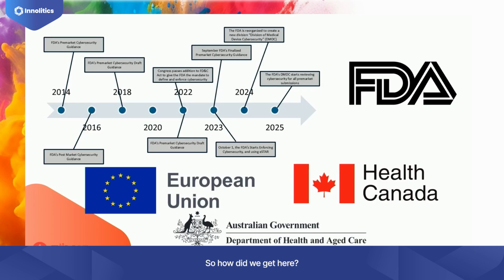So how did we get here? Well, over the last 10 years or so, starting in about 2013, the draft pre-market cybersecurity guidance came out from the FDA. It was 7 pages in length and basically said you need to make your medical devices secure, and we like puppies and unicorns are cute, with no concrete examples of what that actually meant or how to prove it to the FDA. Huge disservice to our industry as developers because nobody knew what to do. So when you're confused and don't know what to do, you ignore it. And that's what the vast majority did in the industry.